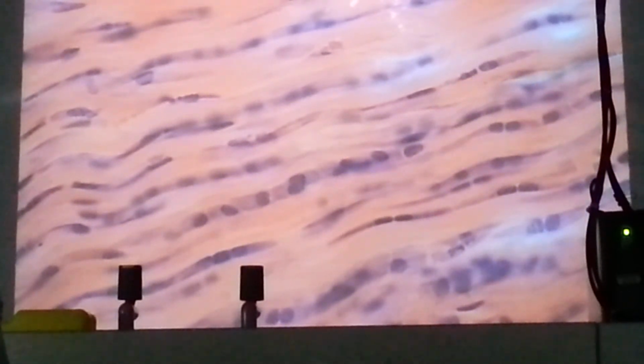So what is the diagnosis or the name of the section? Tendon. You can say dense regular connective tissue. Why? Fibers run in one direction. Fibrocytes in rows, like a piece of wood, in between collagen fibers or collagen bundles. That's it.